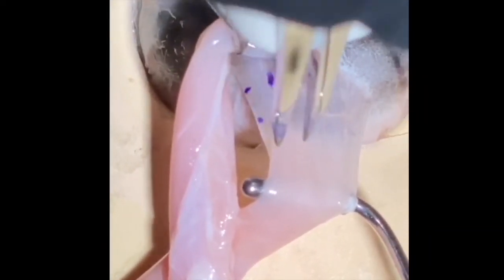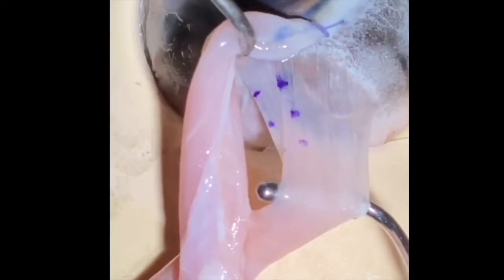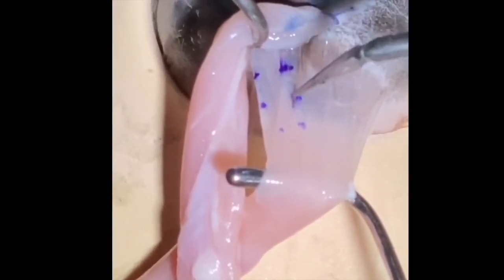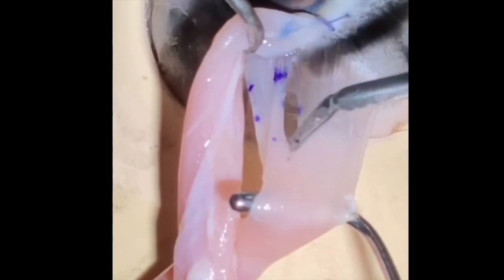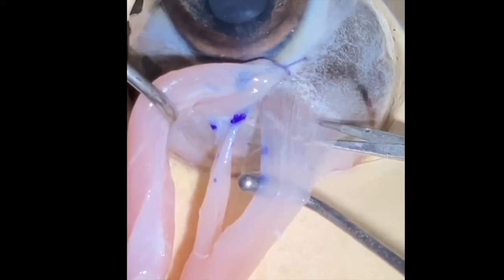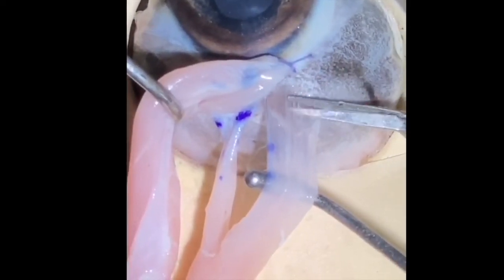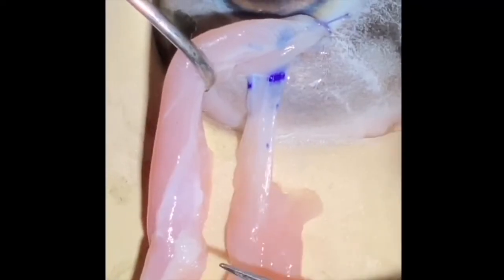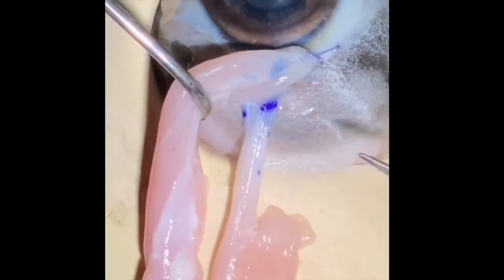To perform posterior tenectomy of superior oblique, anterior 2 mm torsional fibers are identified and marked. These are then separated from the posterior fibers using a Vannas scissor. The posterior fibers are disinserted and a long segment is resected, leaving behind the anterior torsional fibers intact.